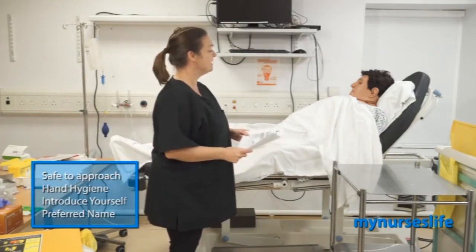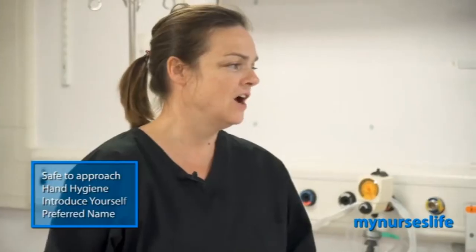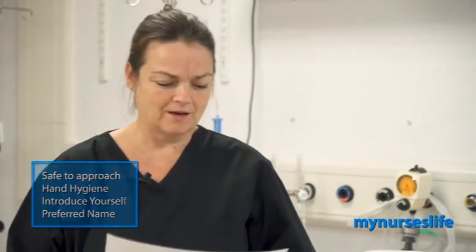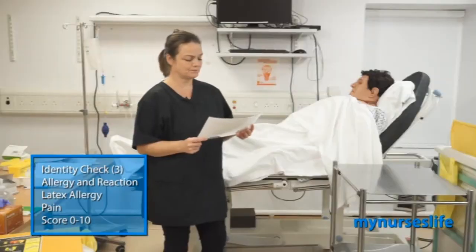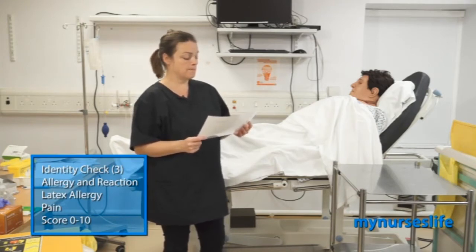Hi, my name's Helen. I'm the nurse working in the community who's come to see you today. Can I just check what you want me to call you? Emma. Okay, Emma. It's okay to do a full ID check first. Okay. What's your name? Emma Hargraves. Okay, and what's your date of birth? 26th of 9th, 1963. And what's your address? 2 Long Street, Northampton, NN2 7AL.